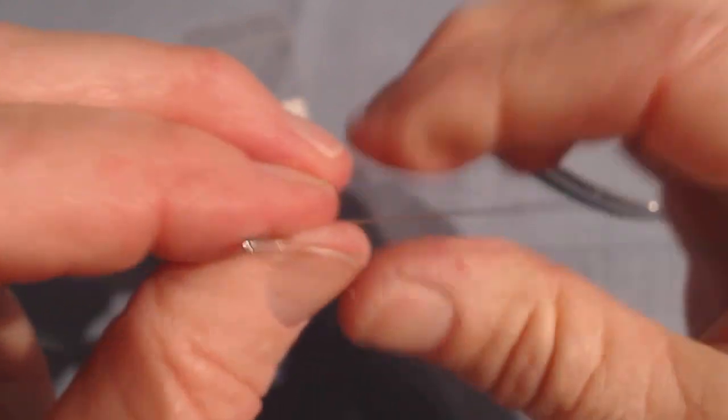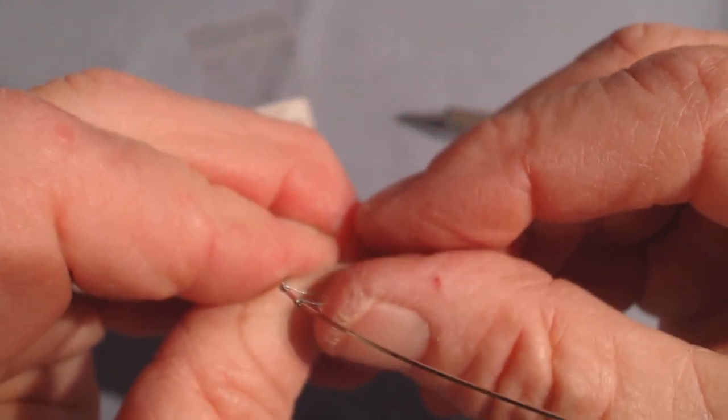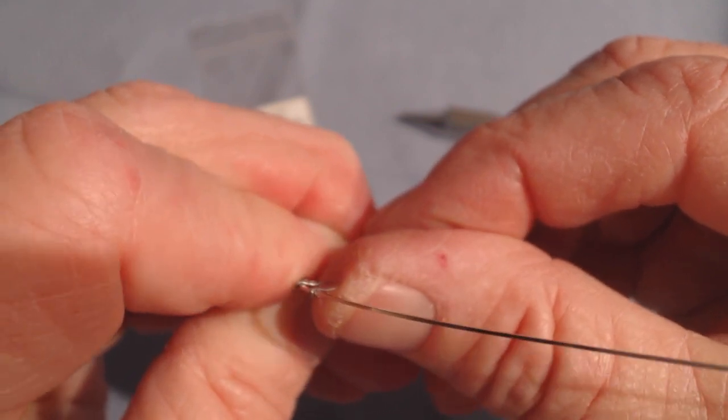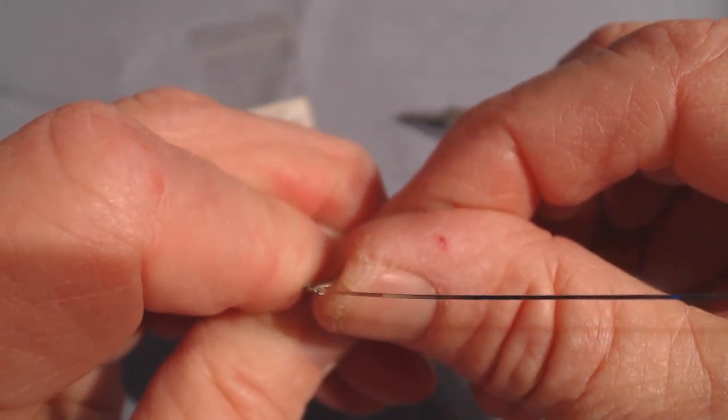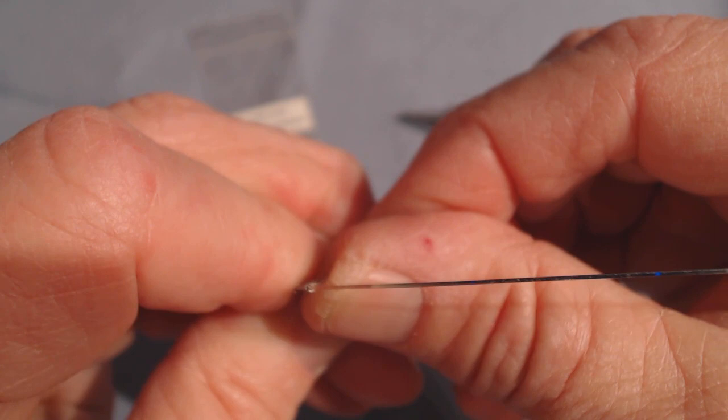So, if I have it upside down, and I press this up against the central incisor tooth, and then what's going to happen, the coil is going to unwind, and it will sometimes slip on the arch wire. So, that's your first one. Now the second one has to go on in the same fashion.